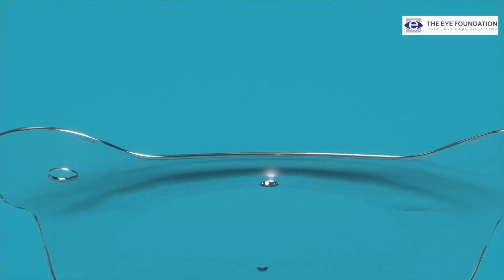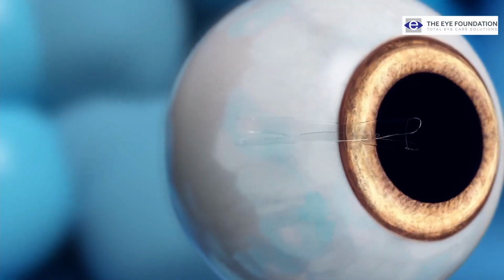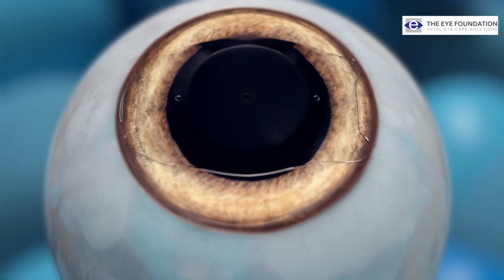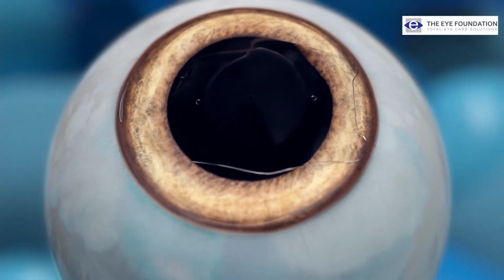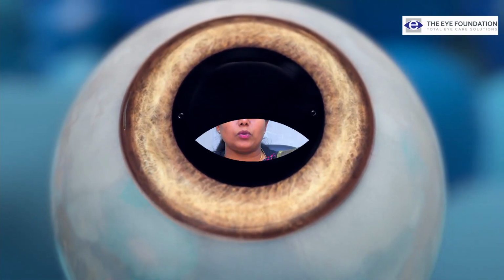So what are these lenses? These are customized lenses based on the patient's refractive error, and we make a small micro incision in the cornea, and the intraocular lens is injected into the eye. It is tucked in above our normal lens, and these correct the refractive error of the patients, and the patients get rid of glasses or contact lenses even though they are not eligible for LASIK.